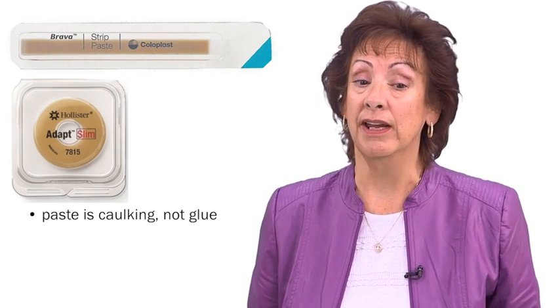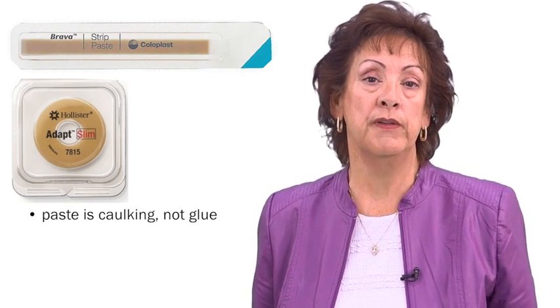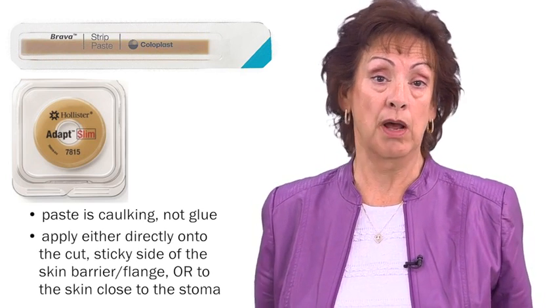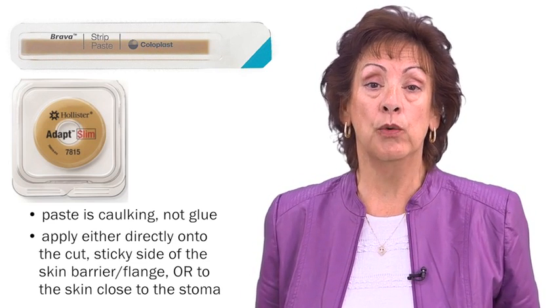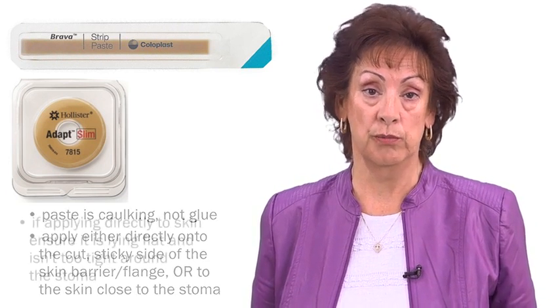Barrier rings or strip paste are different types of paste that help to increase the wear time of the ostomy appliance. Paste is caulking, not glue. If it has been recommended to use one of these products, you can either apply it directly on the cut opening of the skin barrier or on the skin close to the stoma.